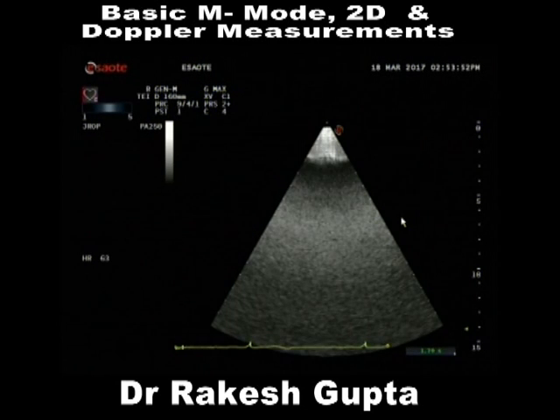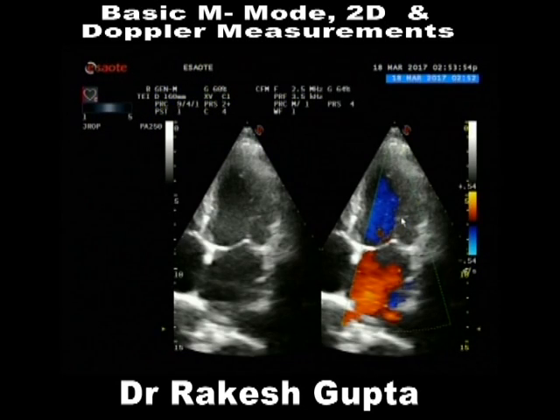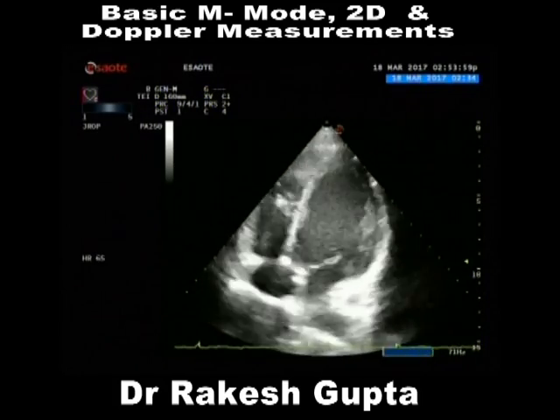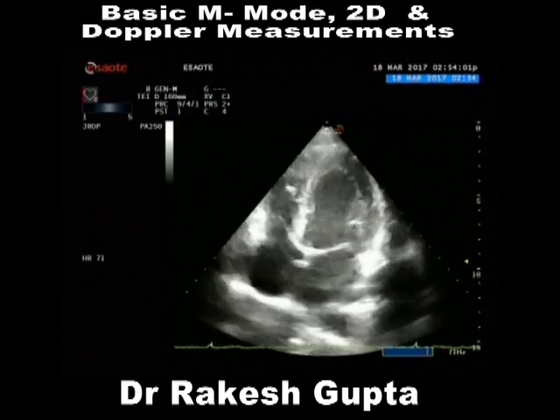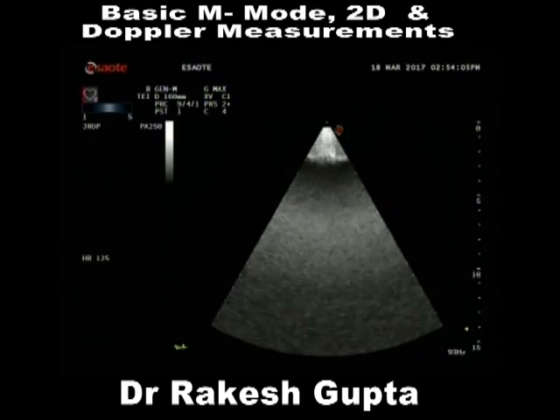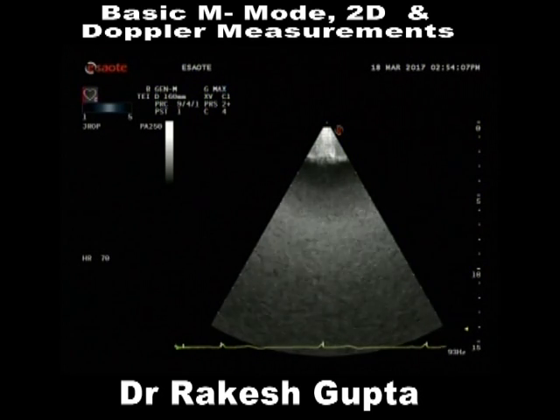So, a huge number of measurements are available today, but we are not going to look at all those measurements. We are going to look at only specific measurements which you will require every day in your practice. Now, the first measurement is in the parasternal window.